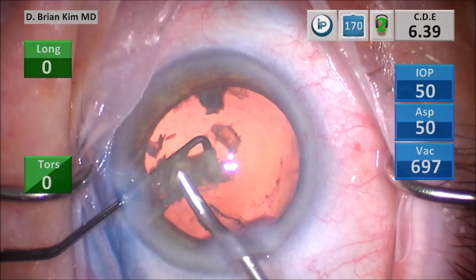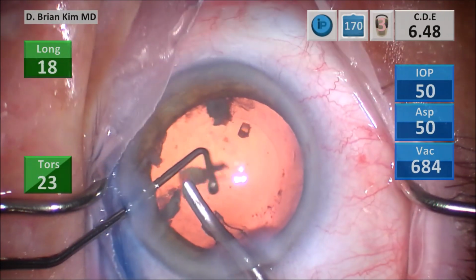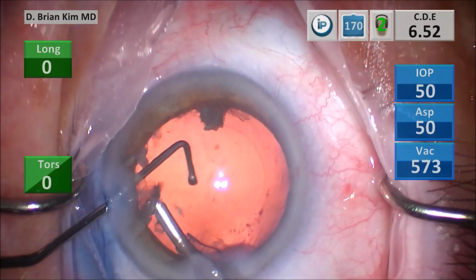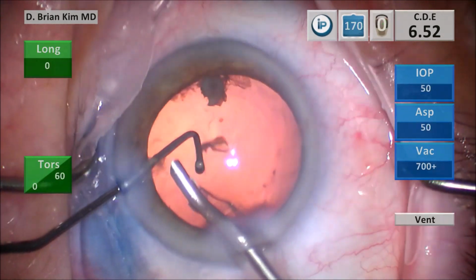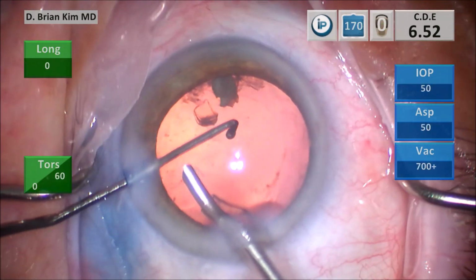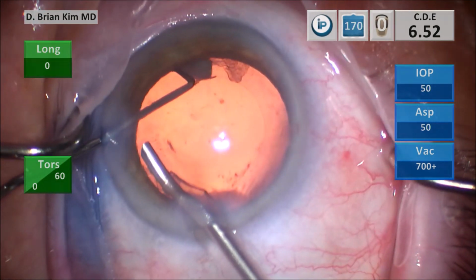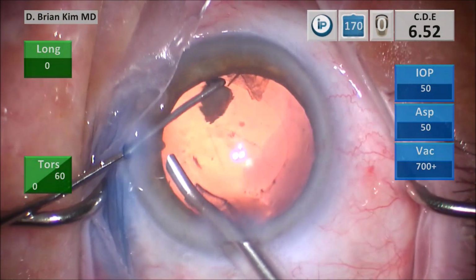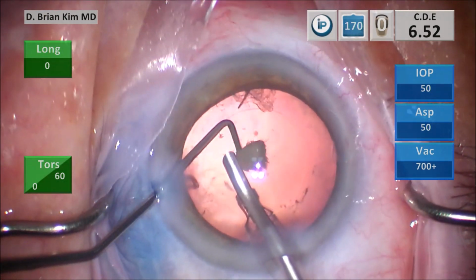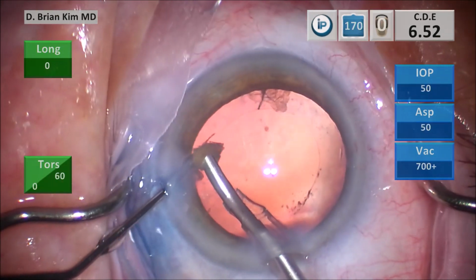So now really these are just the final fragments. I really want to protect the posterior capsule at all costs. I'm keeping that chopper deep in the bag. There's that one final piece that's in the bag, and you can see I'm just using the chopper to hook the lens piece up out of the bag. Again, this is under irrigation only. I'm using the chopper almost like a rake to gently pull the piece up towards the phaco tip and then emulsify the lens piece.